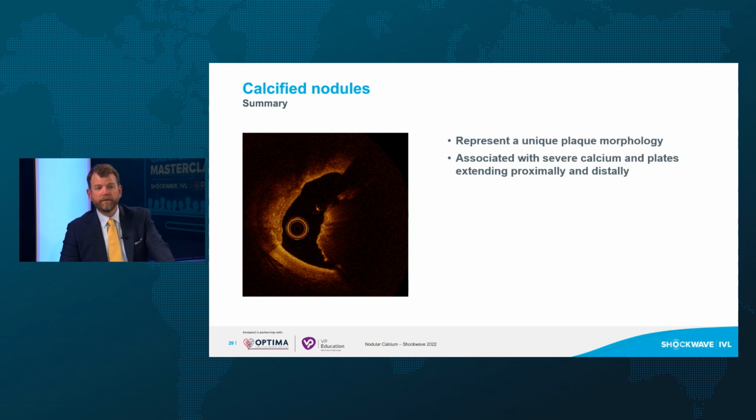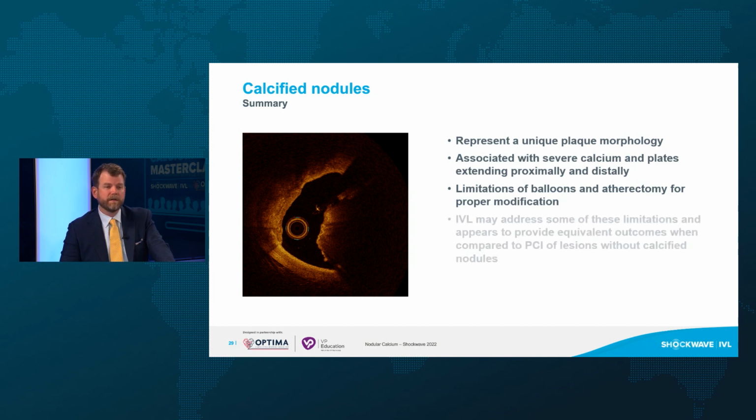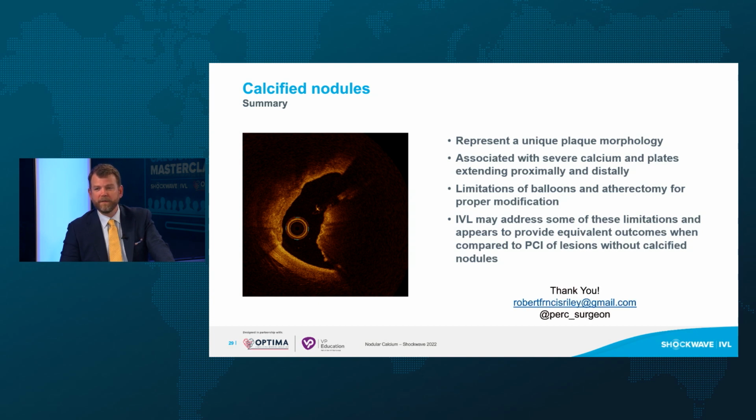They are often associated with severe calcium in plaques, proximally and distally, which is really good, again, because that allows our shockwave to work in ways that other technologies can't. There really are limitations of the older technologies that we've talked about, and IVL seems to address some of these limitations to provide similar outcomes for those with and without calcified nodules that we just haven't seen with other technologies. Thank you guys very much.